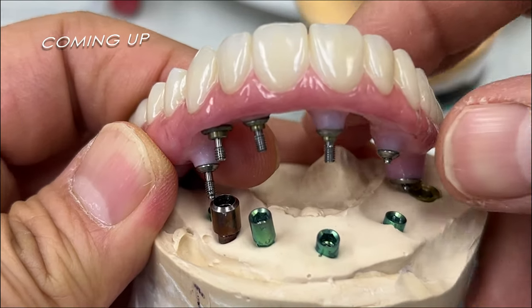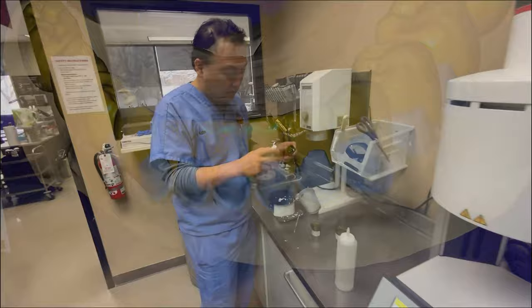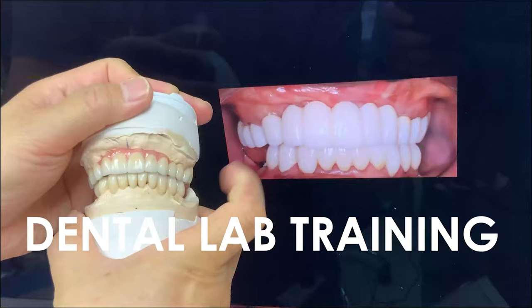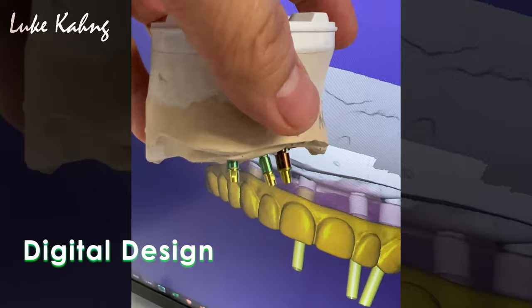Okay, this is the final stage, the 7 implant, and we modify the angle screw channels. So we changed three angle screw channels. The first one would have been out here, right on the inside of the ledge.